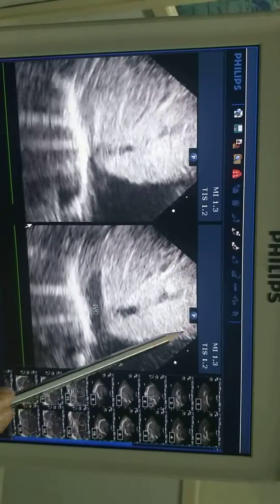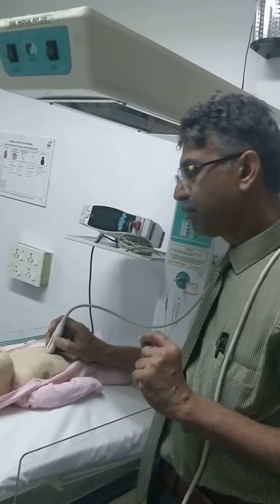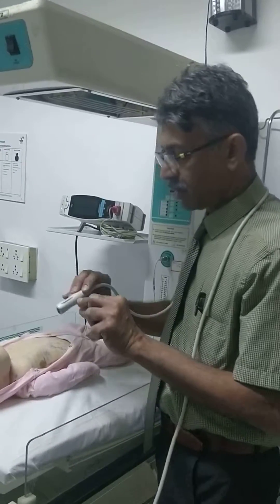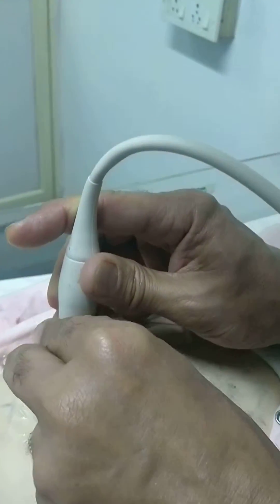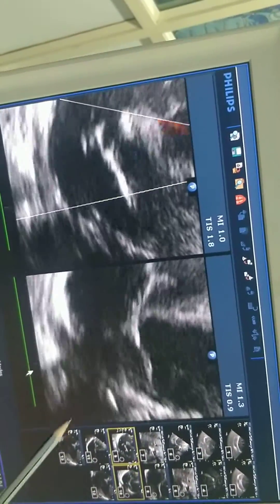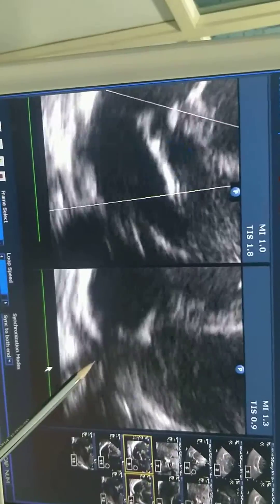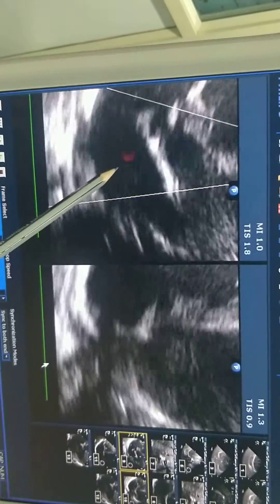In the still image also you can see the right atrium. Now, to demonstrate the connection of pulmonary veins into the left atrium, you can keep the probe in the apical area with the marker facing to the left. To demonstrate, you can see here both the grayscale and the color Doppler. This is the left atrium. You can see tubular structures in this area — they are pulmonary veins entering into the left atrium. You can see the color flow of pulmonary vein flow entering into the left atrium.